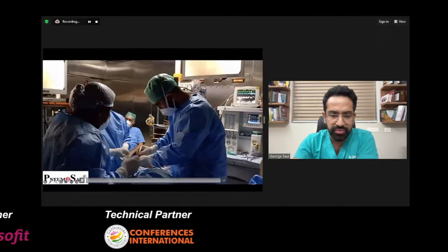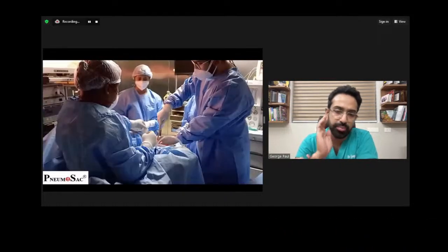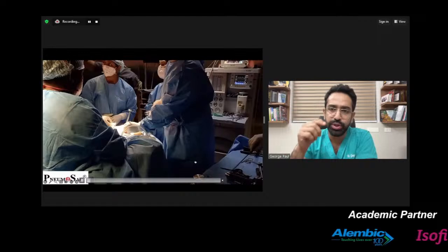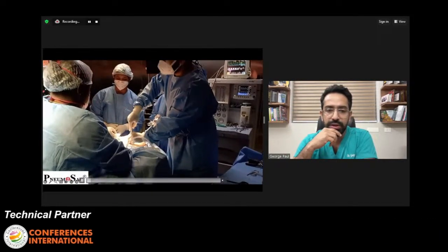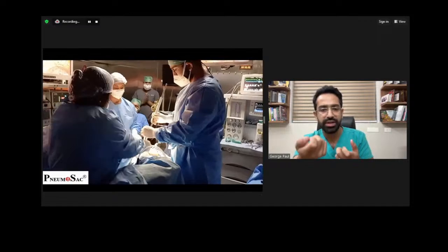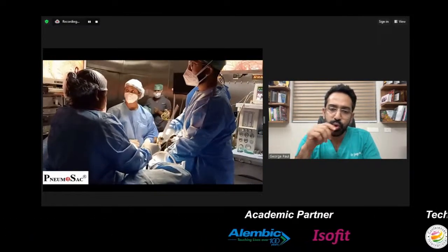So there have been various bags available. This is another bag developed by an Indian company. I'll just show you how it is easily inserted. We normally put it through the suprapubic port, mainly because the lateral port, sometimes after closure, entraps nerves and causes pain. So we normally do it through the suprapubic port.